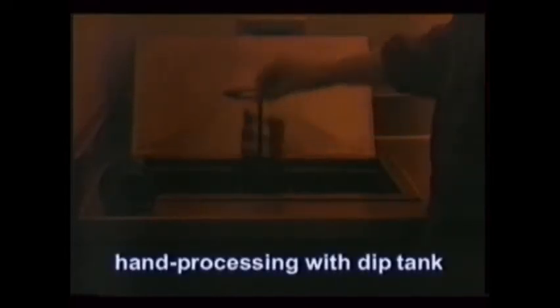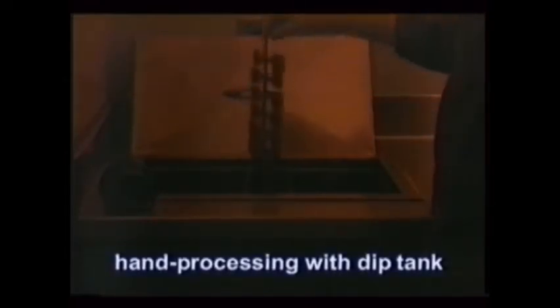Finally, processing the X-ray films completes the process. Modern automatic processors eliminate a lot of errors and guesswork, replaced by a critical demand for machine maintenance. Hand processing using the dip tank or chairside developers still has its place and will be discussed shortly.